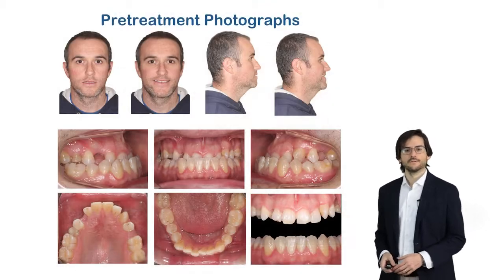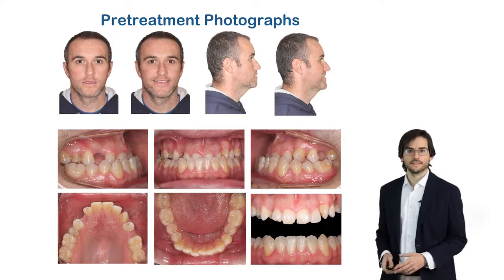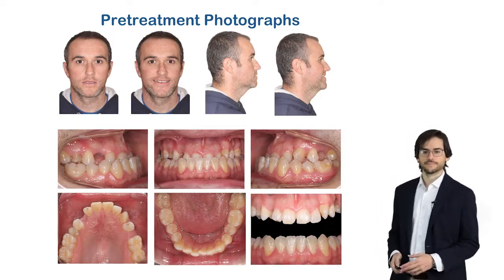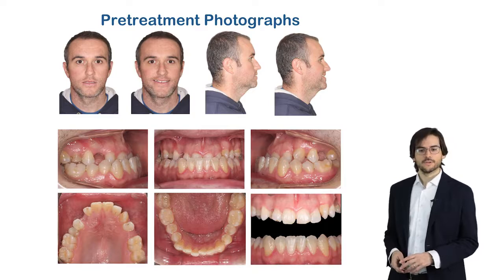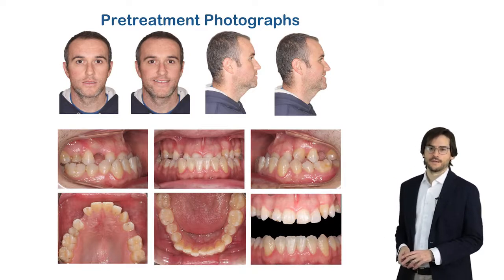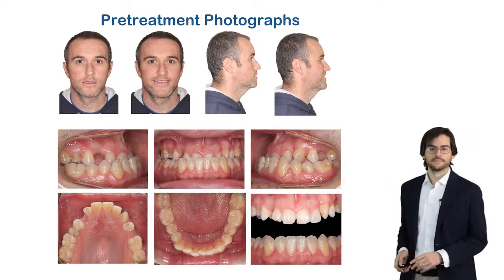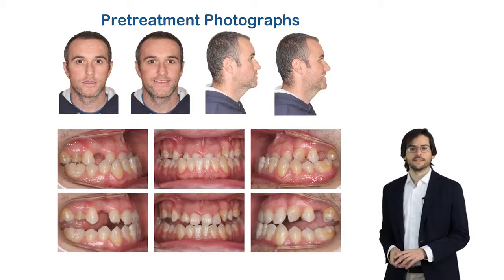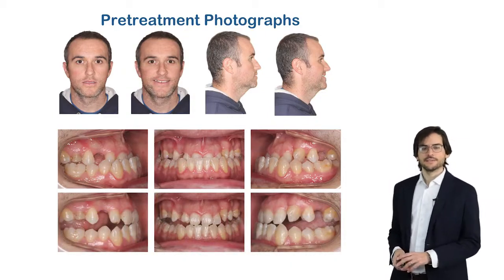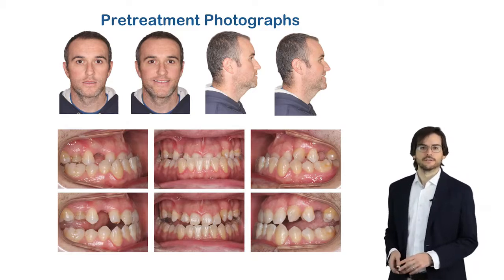Facial photographs showed a well-proportioned face with slight malar projection, a common finding in patients with maxillary hypoplasia. Intraoral photographs showed a bilateral class 3 malocclusion with a complete anterior crossbite. The maxillary right canine was palatally impacted. Functional analysis observed that in centric relation, the patient reduced the anterior crossbite, reaching incisal edge-to-edge contact.